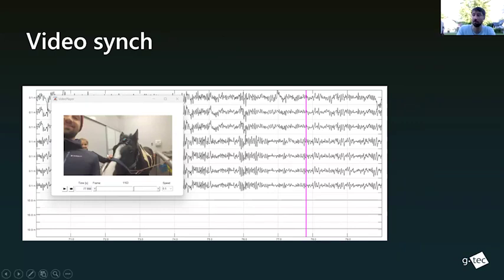They record the animals, for example, in their standard sleeping behavior. They often measure ECG, of course, also additionally, and other parameters. And then they measure here, for example, the EEG in the sleeping environment. And it's very important that you have here a video for synchronizing that gives you all the important markers for your analysis.